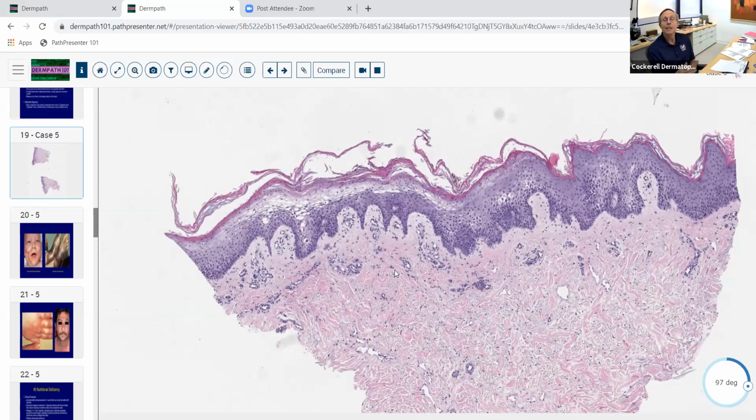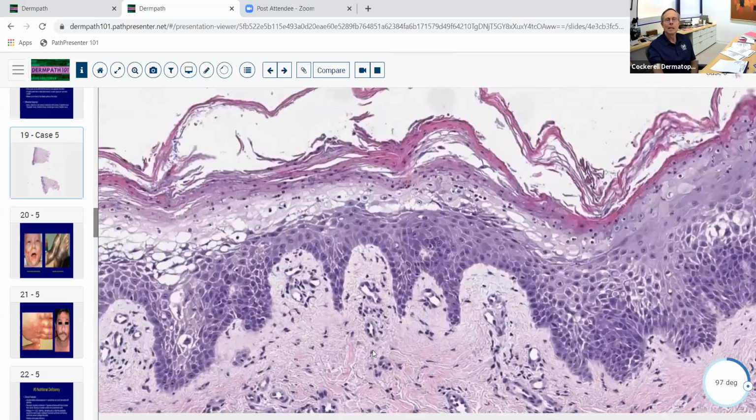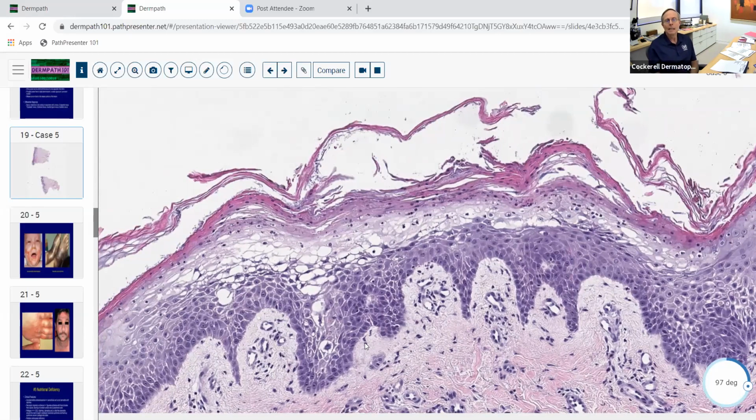And this is classic. If I were writing questions for the board, I used to do that, I would send something like this, because this is perfect. Shows you everything you need to know. It's not controversial. There's no difficulty in making a diagnosis. Anyone that knows anything about dermatopathology, that's been trained as a resident, should know this. In fact, it's so obvious that you might even make a second order question out of it. You might say, which of the following conditions is most likely associated with this histologic pattern? And then maybe you throw in pellagra and zinc deficiency, some of those things. You might say which one of them is not associated with it, and then throw all the deficiency diseases and then throw something else in there.